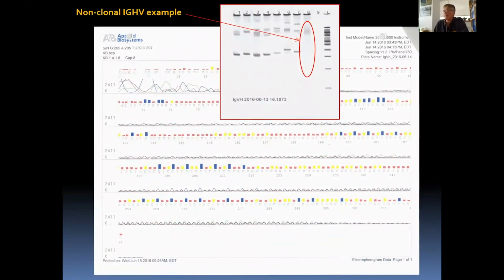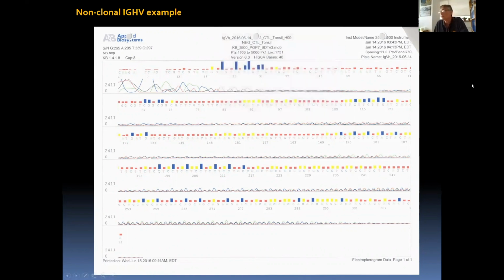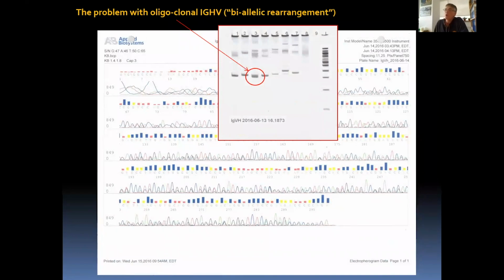If we look at a sample that does not have a predominant clone, therefore we amplify all the VDJ fragments available, of course, there's no predominant fragment to sequence, therefore we get gibberish. I mean, this is obvious, and you can then report that there's not a predominant population of B lymphocytes in this sample. The problem with Sanger sequencing arises when you have biallelic or biclonal or polyclonal fragments.